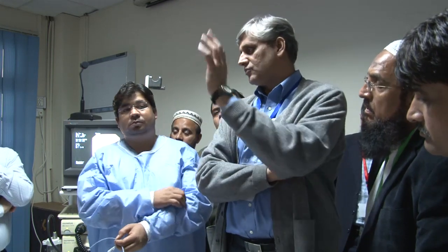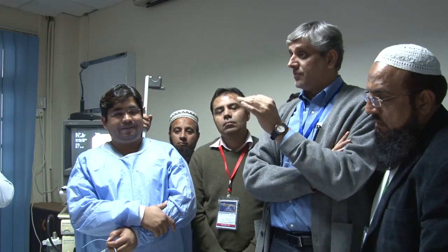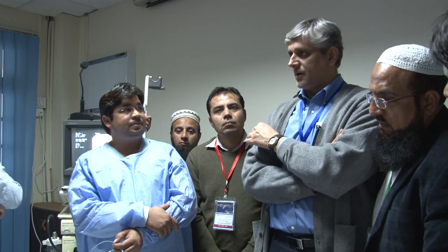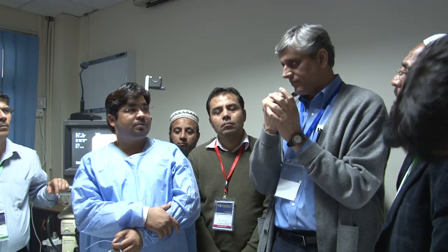So I then tell them to play. I don't have a problem as long as I know I can go back in without any problem. Because once you've played with the ampulla and you come out, मैंने आपको सब कुछ डाल के दे दिया और गलती से आपने गड़बड़ कर दिया, निकल आए, अब वो ampulla can sometimes be very difficult to get in. So that's one of the reasons.